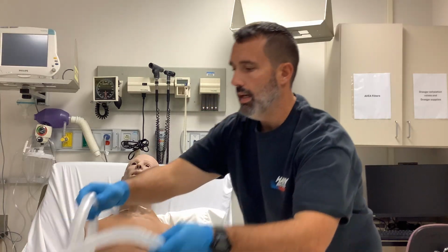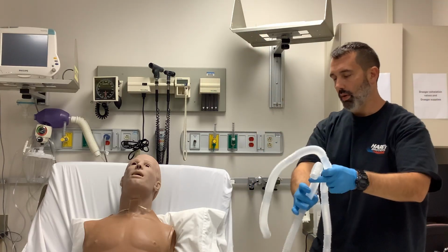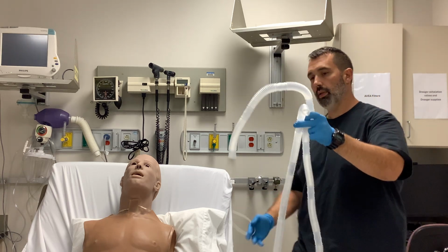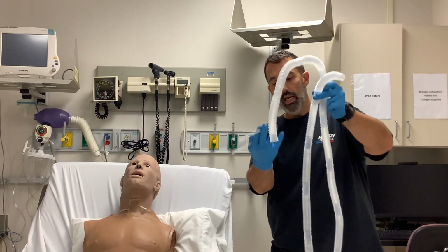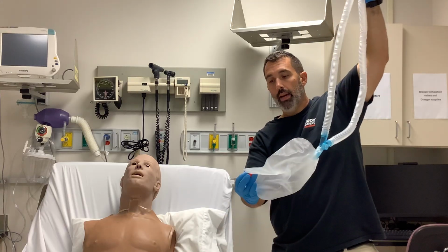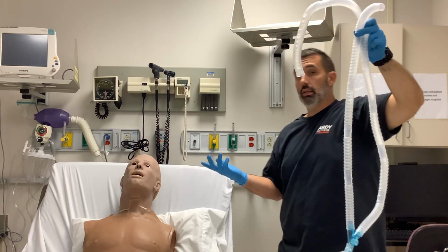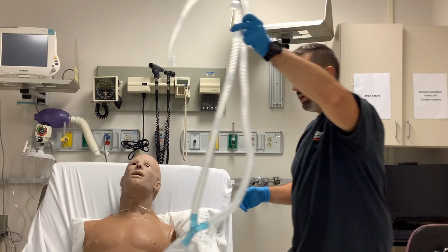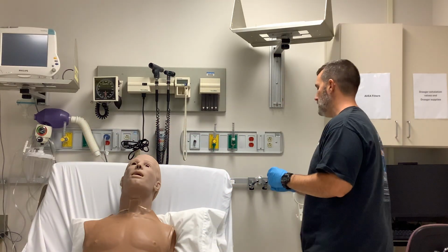corrugated tubing. So I've got two pieces of corrugated tubing here that have an aerosol drainage bag. Typically that aerosol drainage bag should be at the lowest point. There comes a little clip. You can hook that in and arrange that at the lowest place. That way the water that accumulates inside of the corrugated tube, and gravity can do its thing and allow it to drain down to this bag. Knowing that it drains down to that bag, there is a little red cap there, so you're going to want to make sure that you cap that, or else the water that runs into that bag is going to run onto the floor. When you walk into the room, you're not going to see the clear water on the floor, and you may take a trip, and depending upon how bad it is, maybe a trip to the ED. Hopefully not, but maybe so.